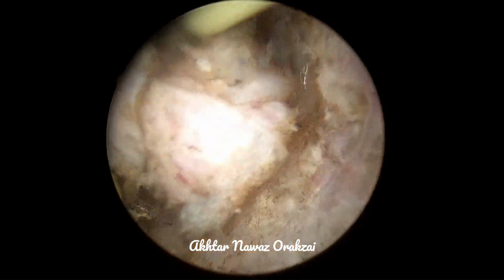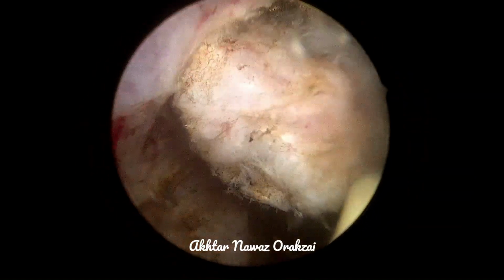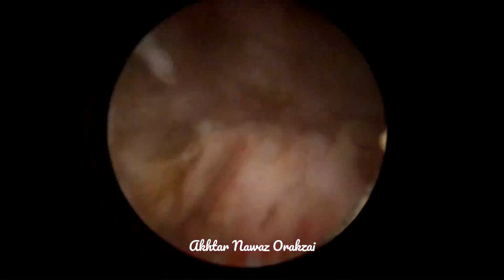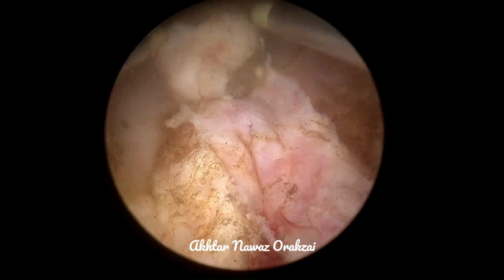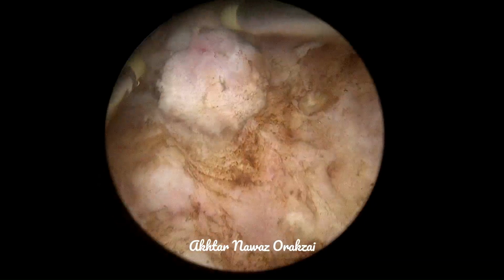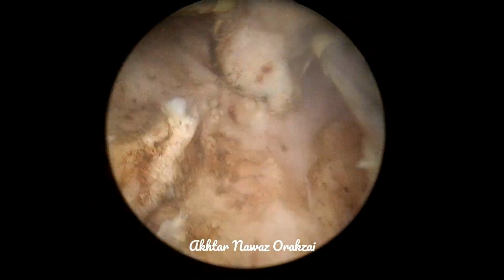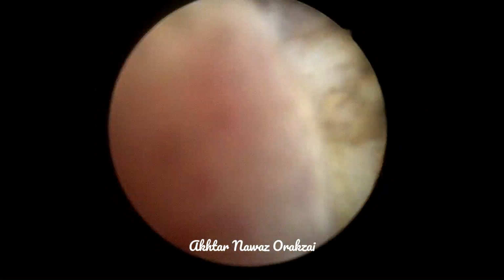While discussing the breach in the capsule, we made another hole in the capsule as well, and this needs to be avoided. A little more fine tuning, and then we will start coagulating the cavity.